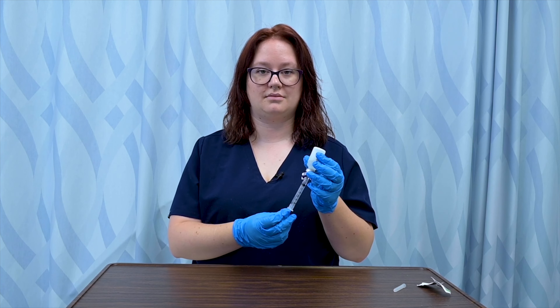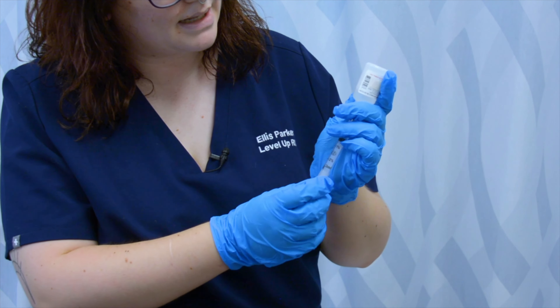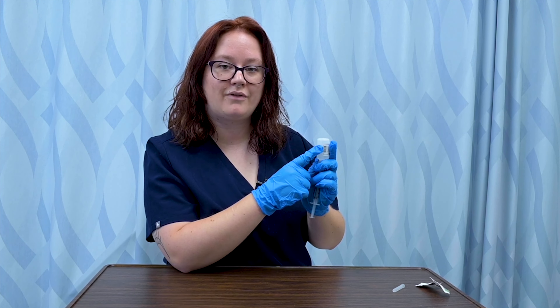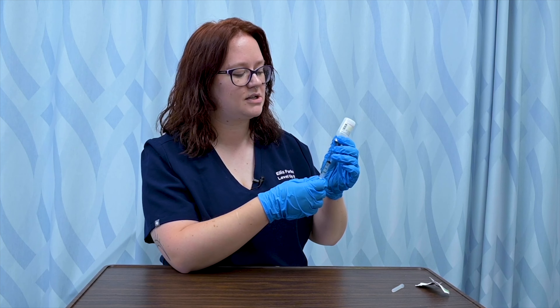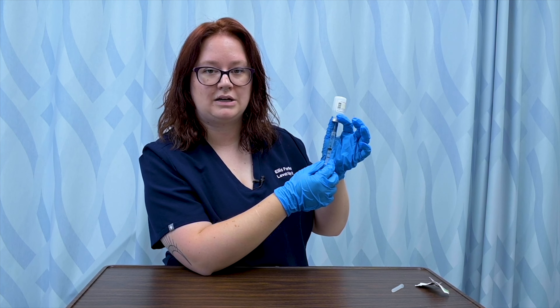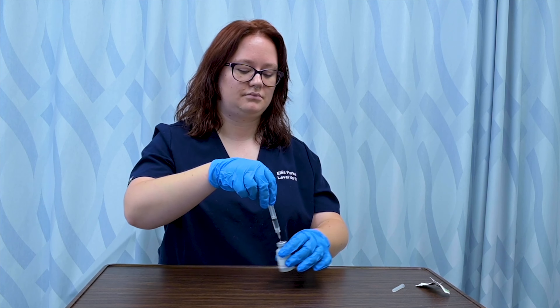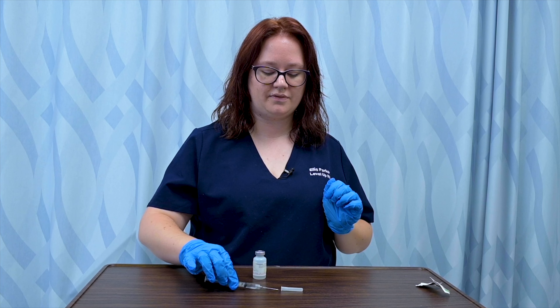I then invert my vial. It's important to see the level of the liquid inside, especially if you're working with a longer needle. As you're withdrawing, if your needle tip goes above the level of that liquid, you'll be pulling out air. This can be confusing for students and new nurses — they're pulling and pulling but only getting air. So sometimes you need to drop your needle down a little bit — not completely out, keep the tip in — but if the vial is running low, drop it slightly to ensure you're getting medication. I'll confirm I have one milliliter and remove it using the scoop method to avoid sticking myself.